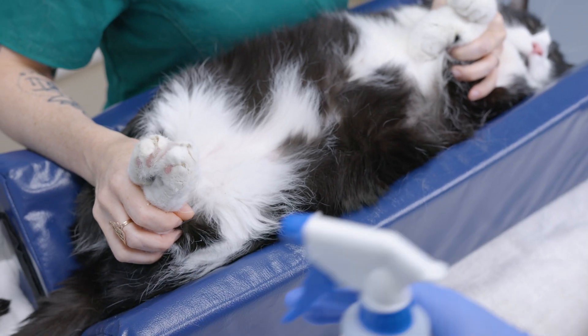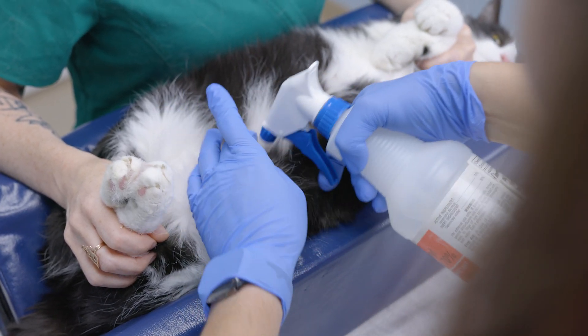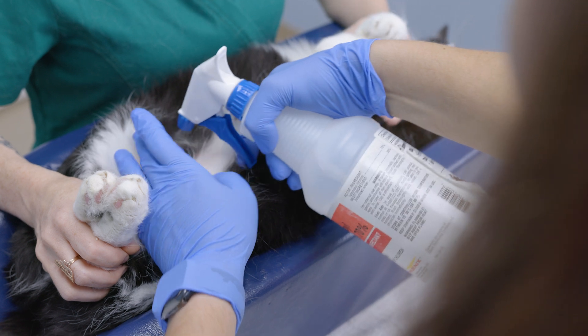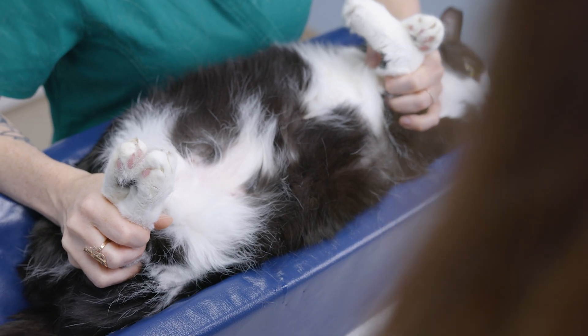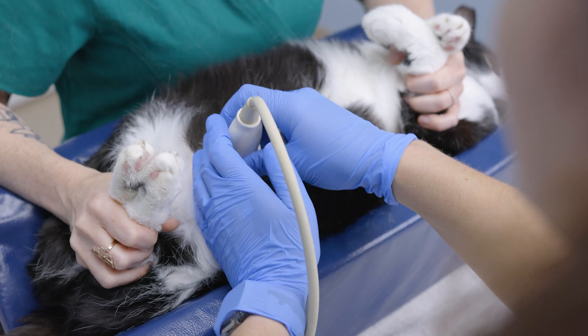We're going to use our alcohol to soak the area down. It helps to put the hair down as well as provide contact for the probe to be able to visualize our bladder.